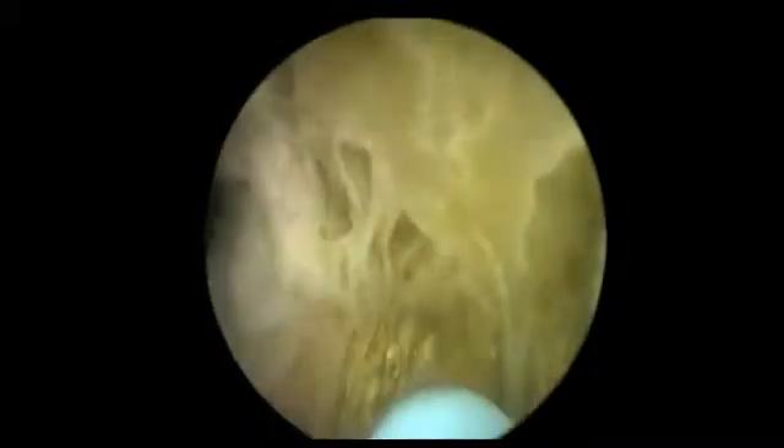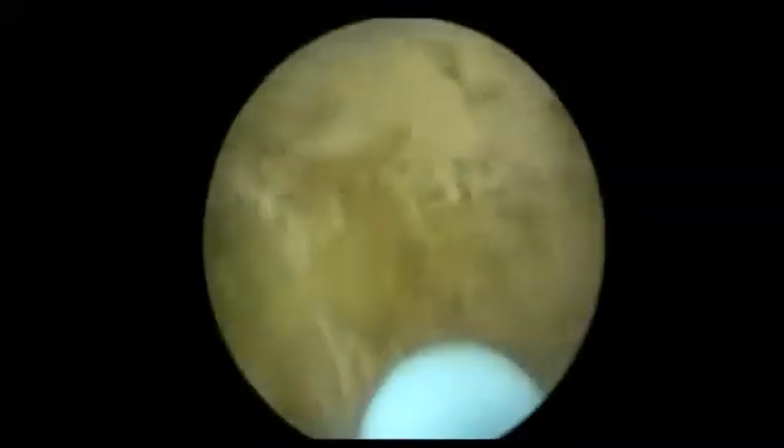This model has a realistic bladder neck edge. Once you reach the bladder neck, be careful not to advance the laser fibre beyond it. There are no ureteric orifices in the model, but in real life these can be quite close to the bladder neck edge.